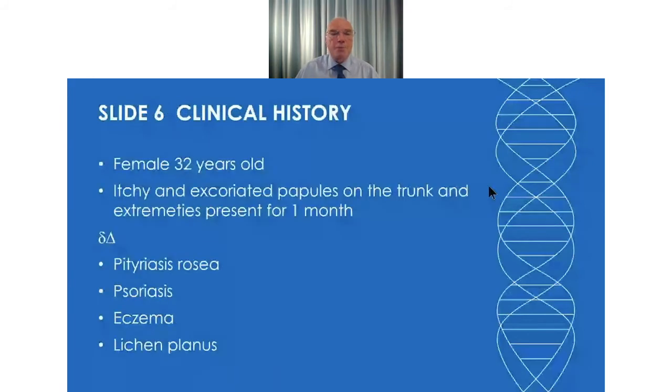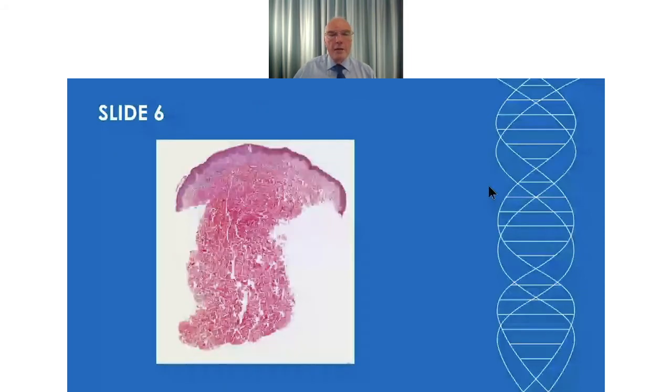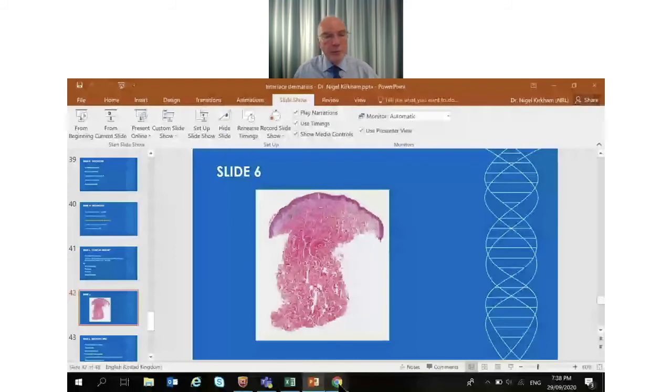So, well done. The last one is from a 32-year-old woman with itchy excoriated papules on the trunk and extremities for a month. Just have a look at that biopsy.